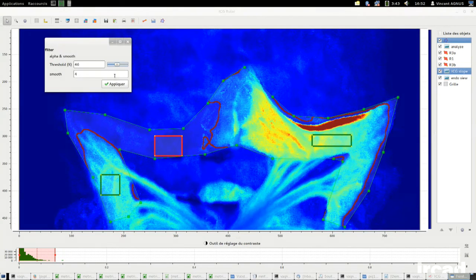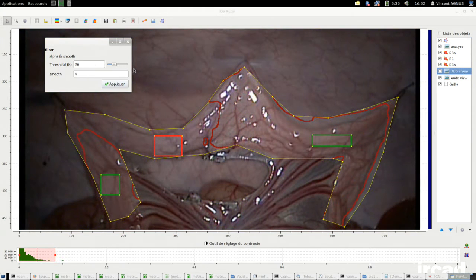The software rapidly calculates the perfusion level to display on the bowel, ranging from 1 to 99% as compared to the perfused area and the ischemic area. In this specific case, the animal was assigned to have a resection and anastomosis at 75% of maximal perfusion.